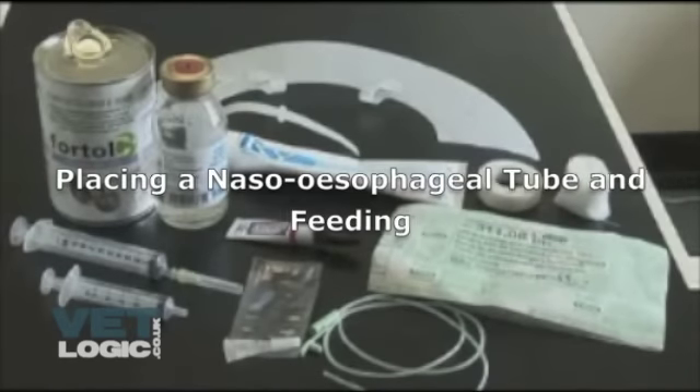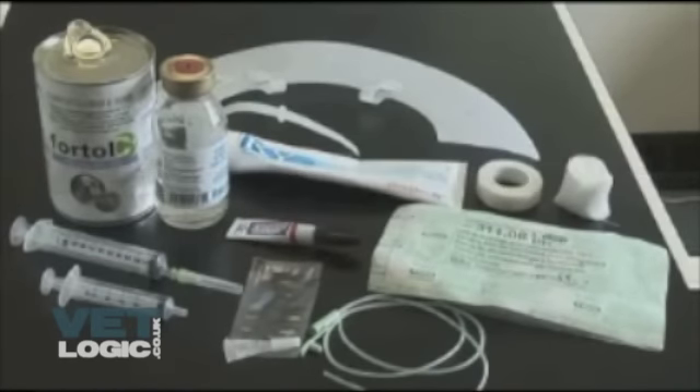Placing a nasoesophageal tube and feeding. To place a nasoesophageal tube, you will need the following equipment.